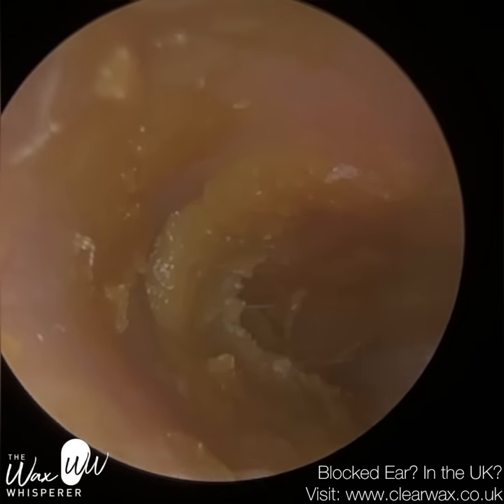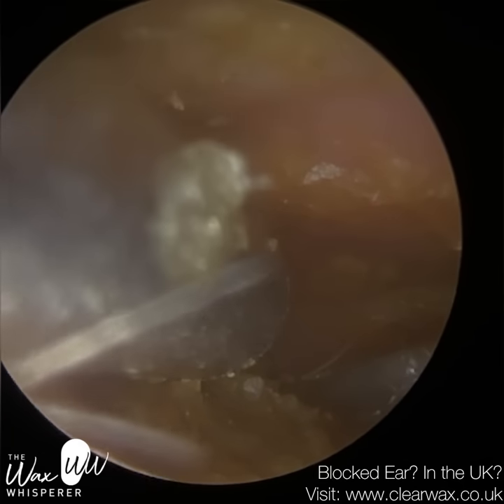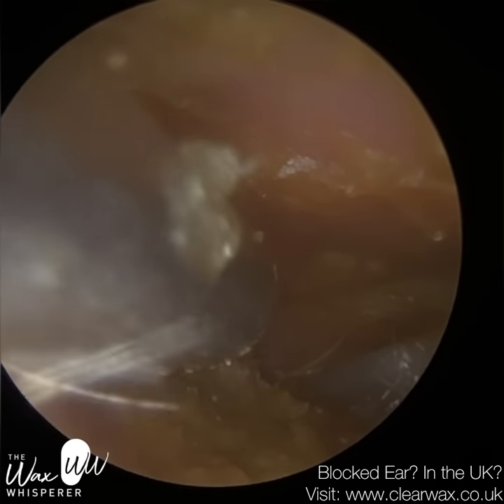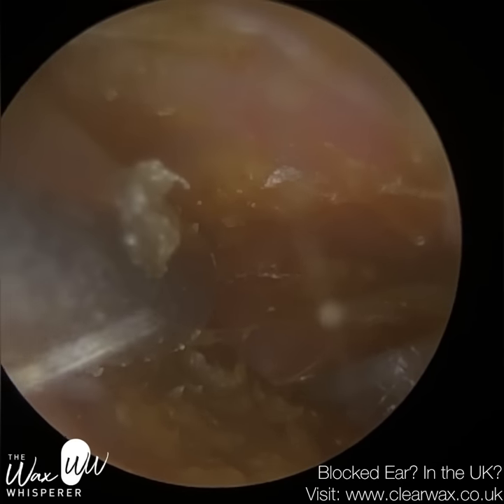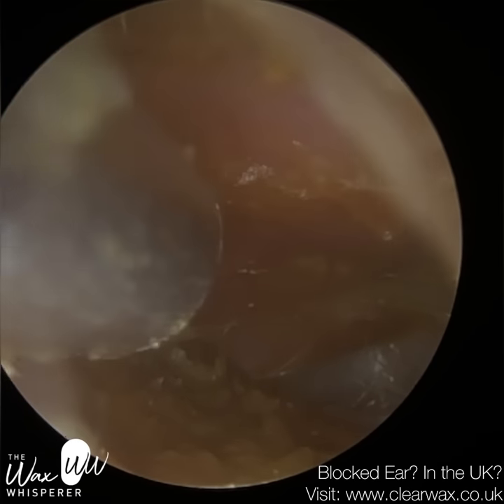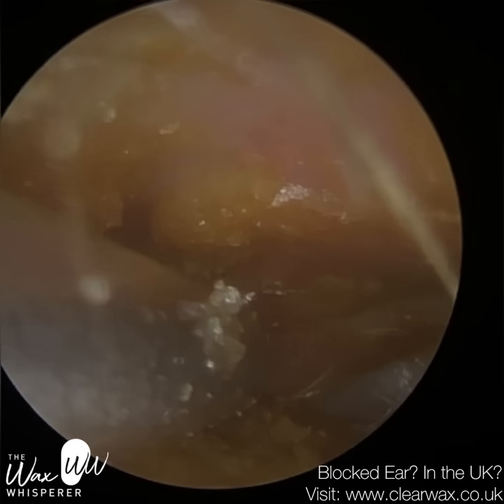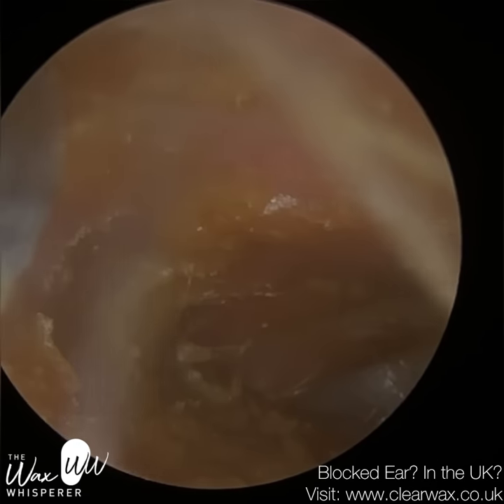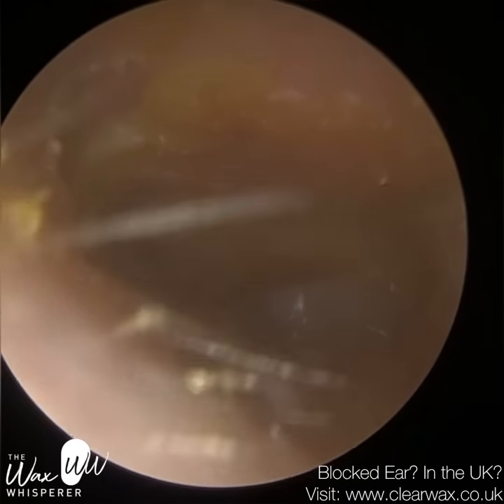We're just entering the ear, and this is the second bend of the ear canal — this is where the ear canal straightens. The second bend is about half a centimetre into the ear canal, about one third in. It's where the cartilage part and the bone meet — the osseocartilaginous portion. When training our ClearWax delegates, I always describe the outer third of the ear canal as being the safe zone, and the inner two-thirds as being the danger zone.